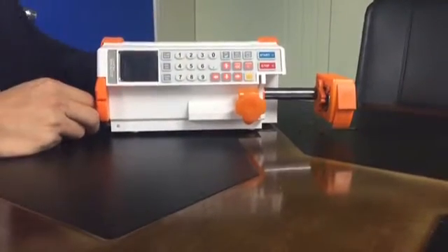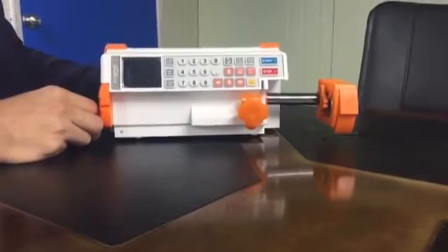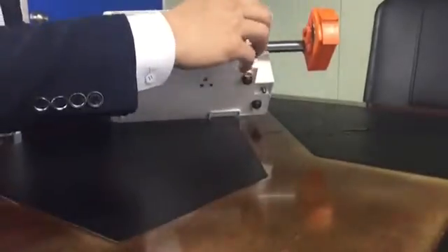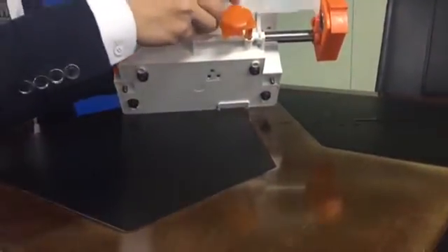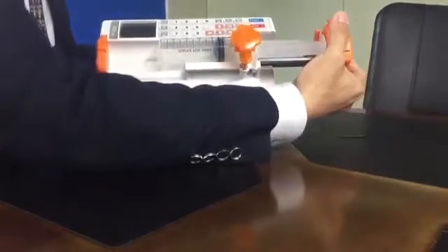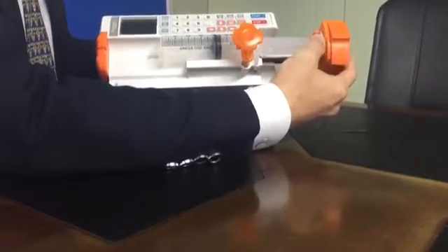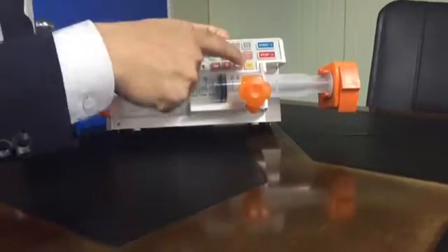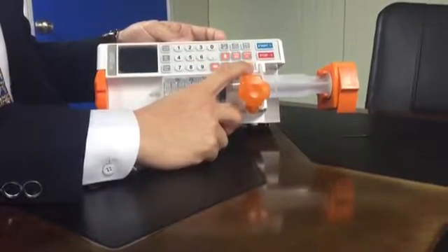This machine is used for infusing a syringe to the patient. You should install the syringe first with this syringe clamp — like this. You can install the syringe with this machine and turn on the power from this power button.